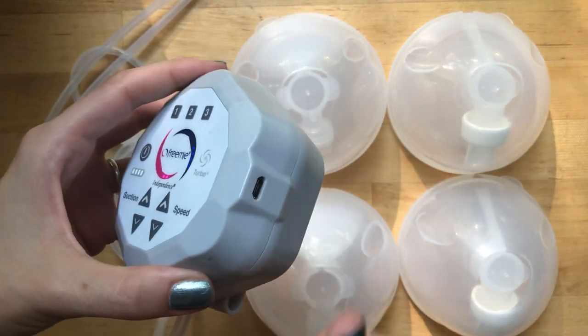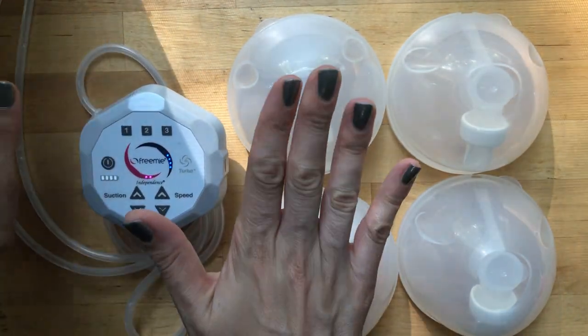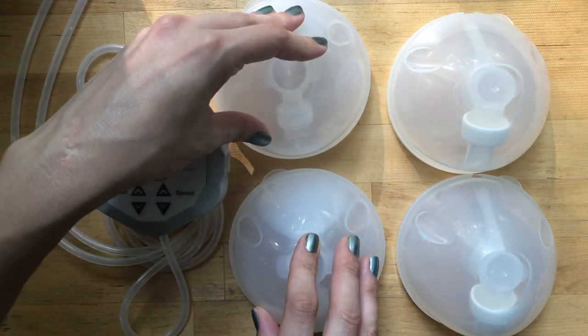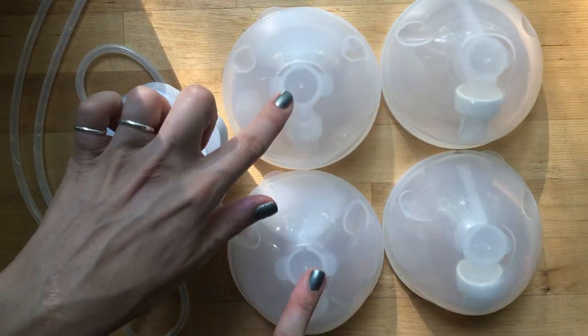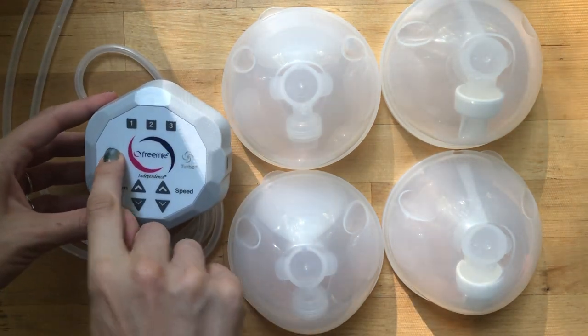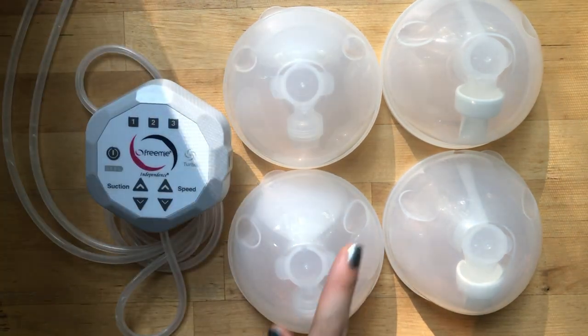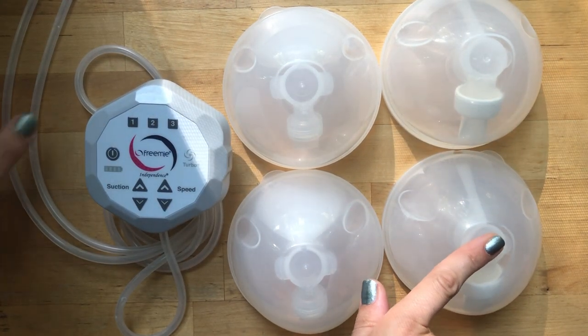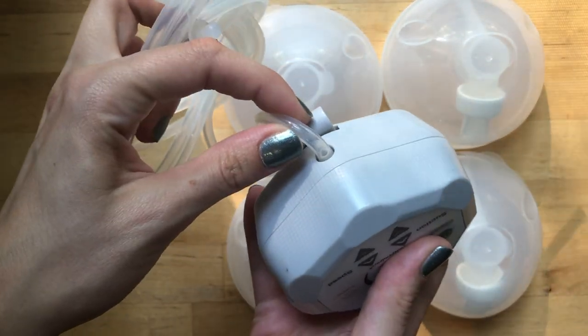What this comes with is the pump, the tubing, the charging cord, and a set of cups. I have two sets here - this is the set that comes with the current pump, which is the newer set, and I also have the older set to compare it to.